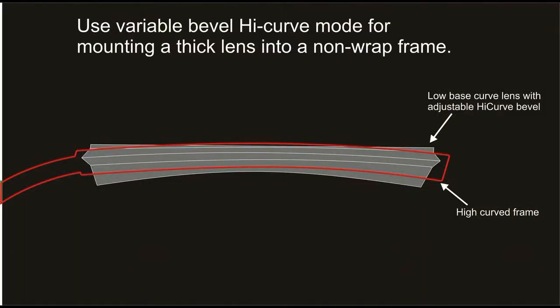Hi, I'm Barry Santini. I'm an American Board of Opticianry Certified Master Optician and today I'm going to be using an MB-1200 edger and an ICE-1000 blocker to show you how to perform variable bevel.